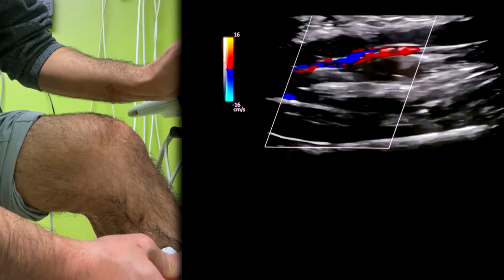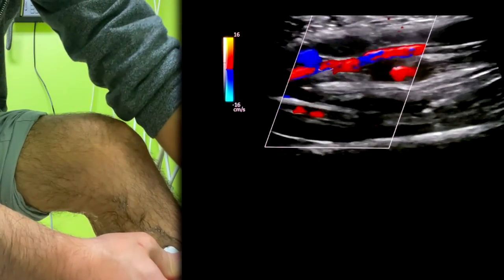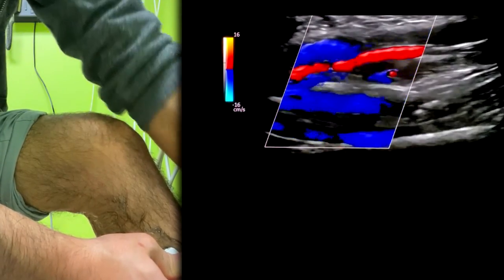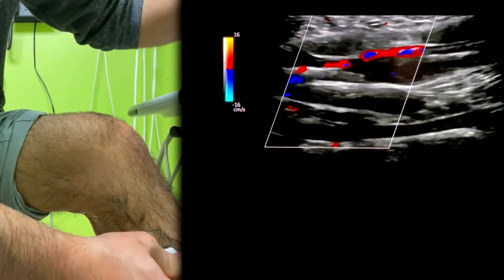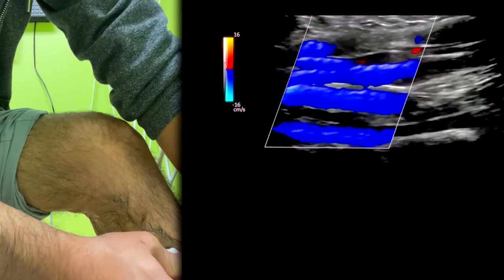That's the other one right there, and if I squeeze you'll see the flow in all four veins. Lower the gain a little bit so it doesn't feel too much — there you go, very pretty.